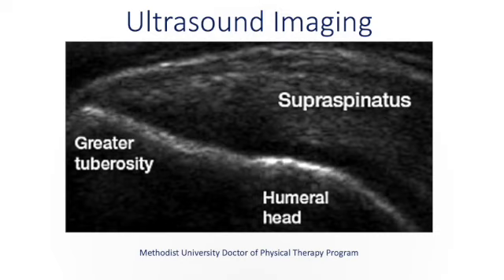And we're going to see that it's not going to involve any sort of ionizing radiation, and it is very cheap to administer. So I think the thing we really need to look at as physical therapists is how we're going to integrate this into our practice and really practice at the top of our licenses.